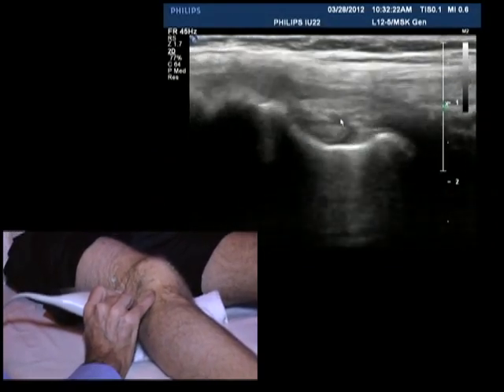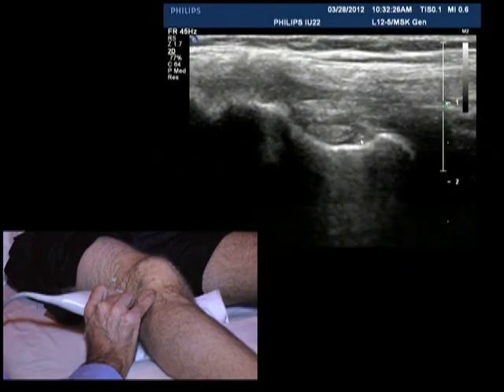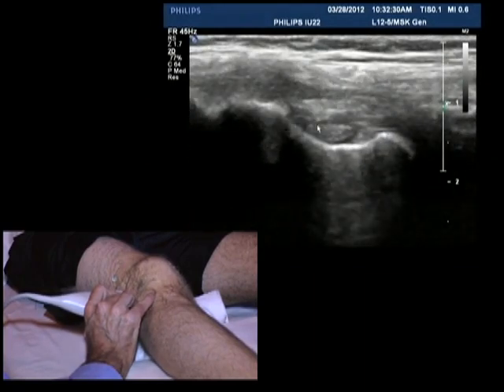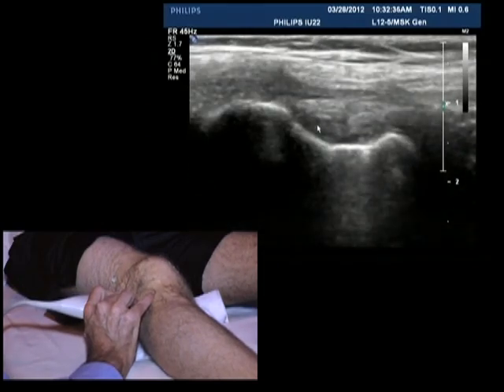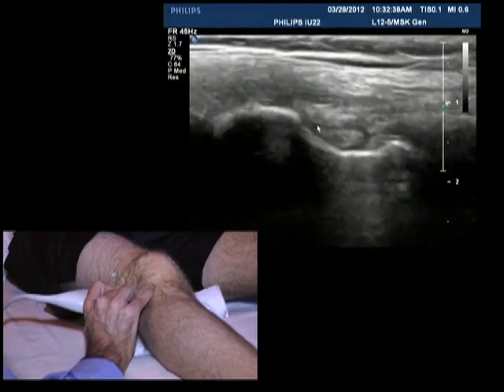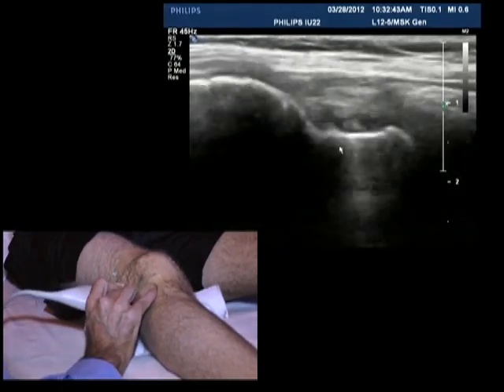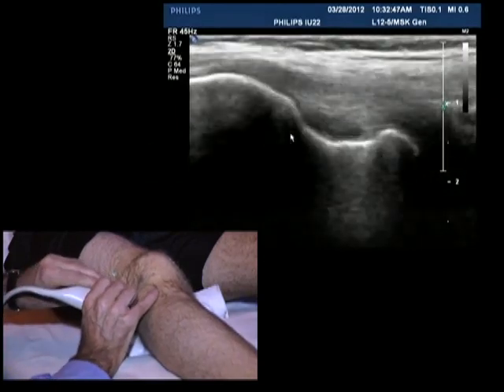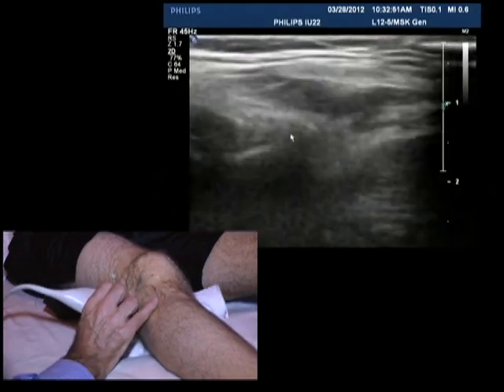That's better. Just a question of reorientating. So here's the notch of the popliteus. See the notch in the lateral femoral condyle. Here's the popliteus tendon, which typically we don't get asked to look at clinically, but is sitting here looking straight back at us if we go looking for it. And then immediately above the notch for the popliteus is the origin of the fibular collateral ligament, the cord-like fibular collateral ligament.